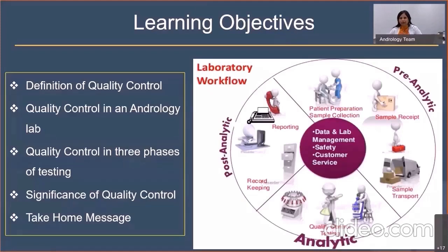On the right side, I've provided an example of a laboratory workflow where the 3 phases of testing are shown as pre-analytical, analytical, and post-analytical. Then the significance of quality control, and finally, a few key take-home points. Next slide.